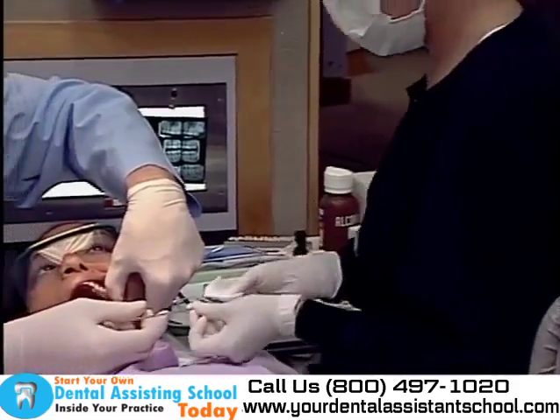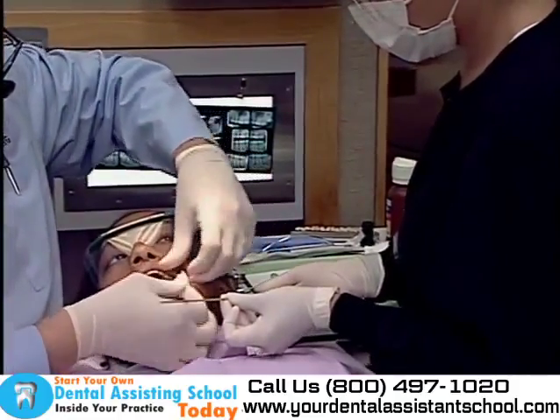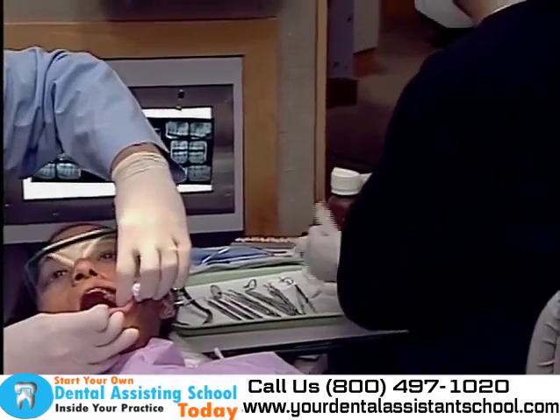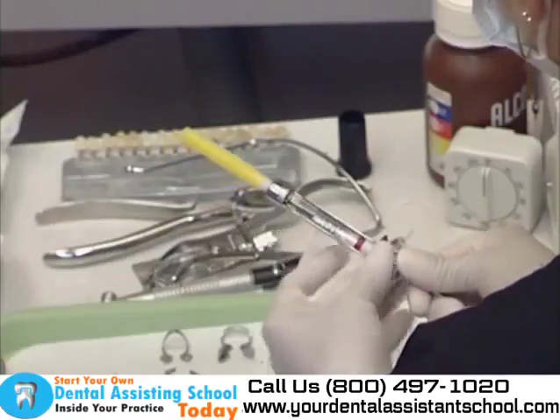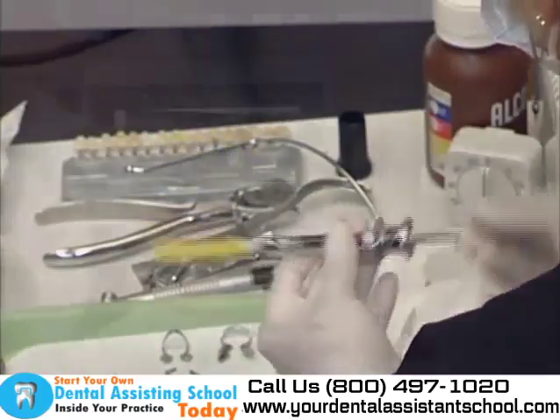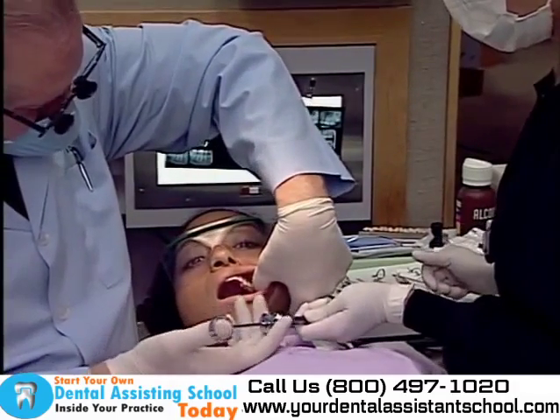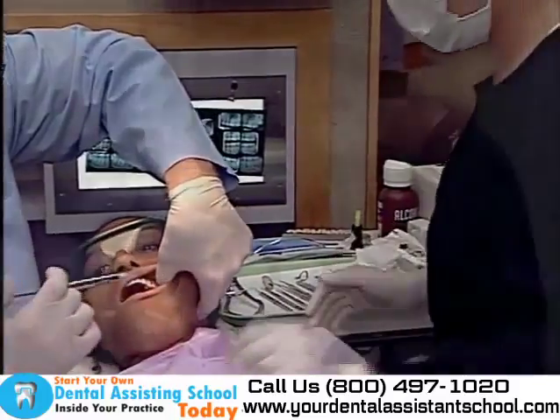Typically, before a local anesthetic is injected, a topical anesthetic is applied with a cotton swab to the area to reduce the discomfort from the needle. The dental assistant assembles the syringe containing the local anesthetic. The dentist injects the anesthetic, while the dental assistant continues to support in the procedure by passing and retrieving instruments.